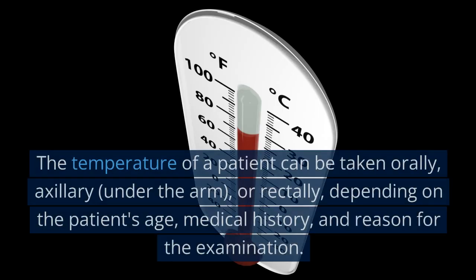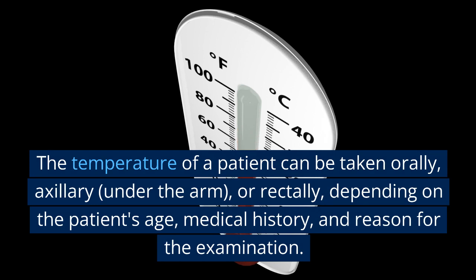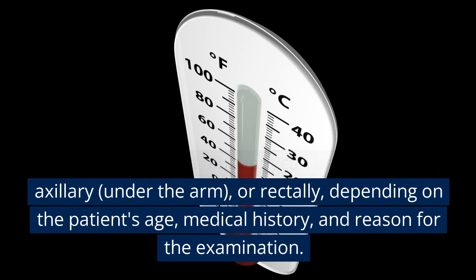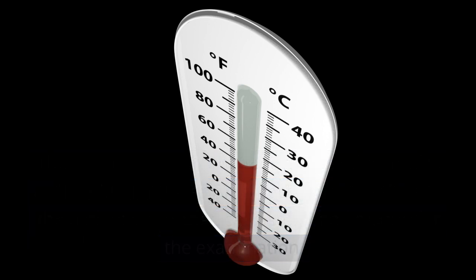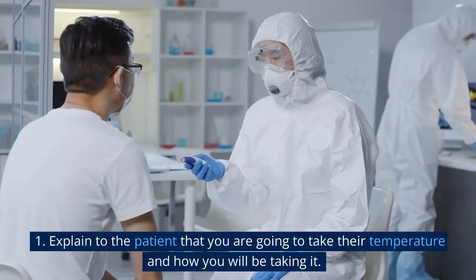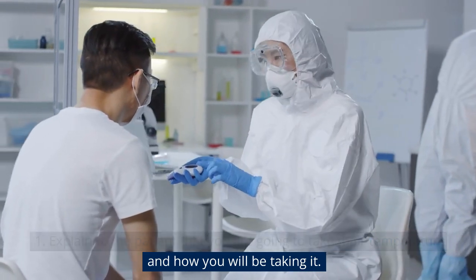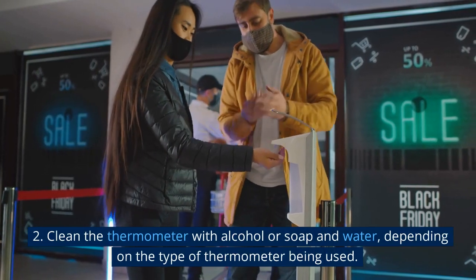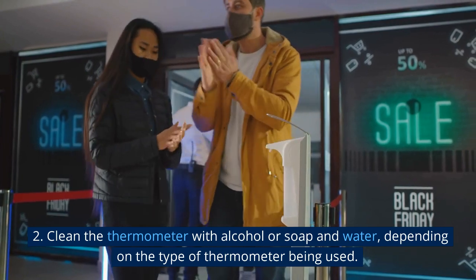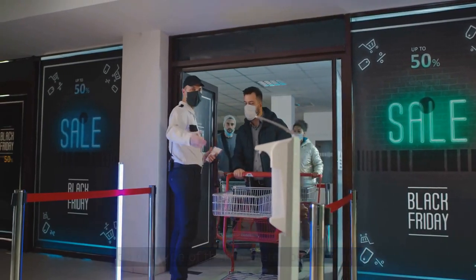Temperature. The temperature of a patient can be taken orally, axillary (under the arm), or rectally, depending on the patient's age, medical history, and reason for the examination. Step 1: Explain to the patient that you are going to take their temperature and how you will be taking it. Step 2: Clean the thermometer with alcohol or soap and water, depending on the type of thermometer being used.